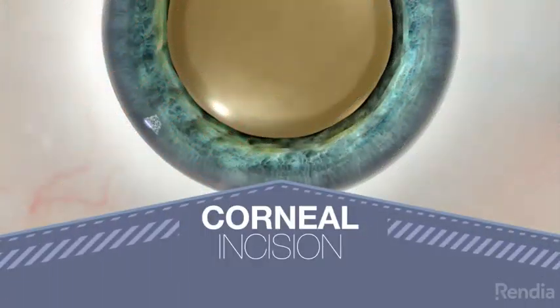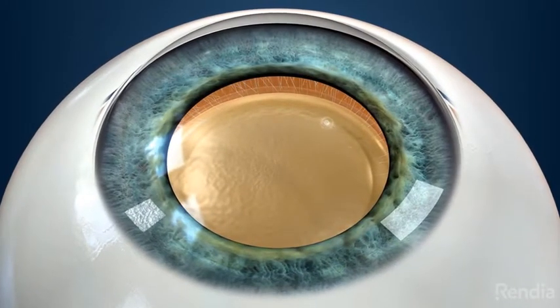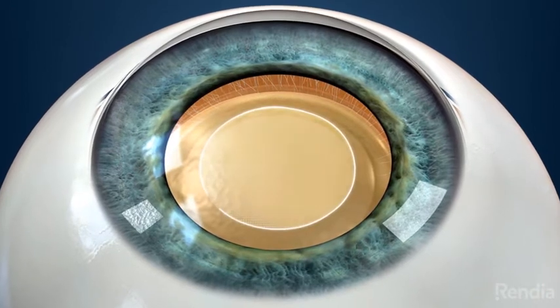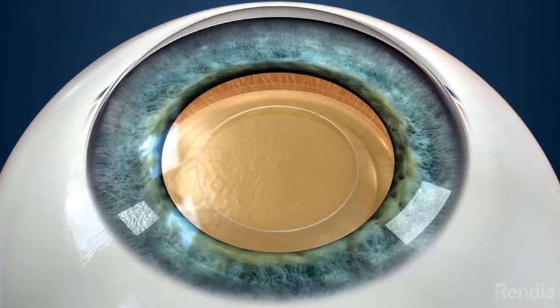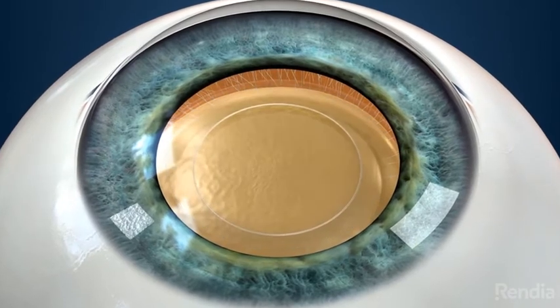First, the surgeon will create an incision in the cornea. This incision is just large enough to pass the surgical instruments through. Following the incision, the surgeon will gently peel off the front layer of the lens. This will allow access to the inner areas of the lens where the cataract has formed.